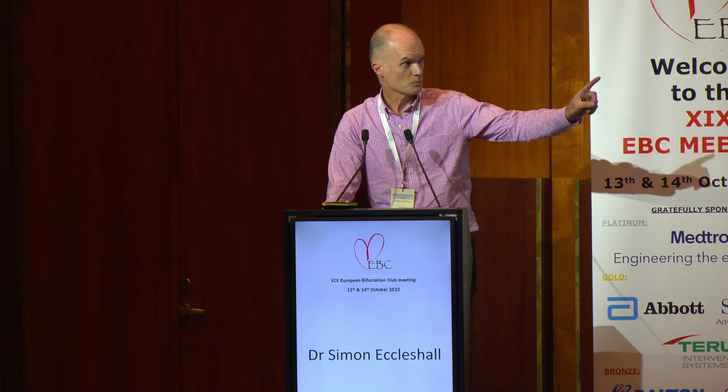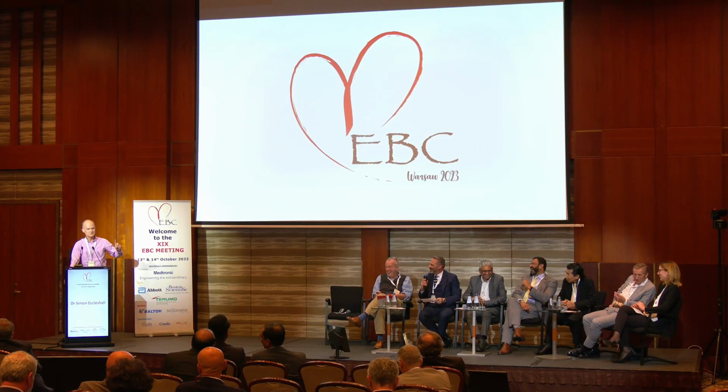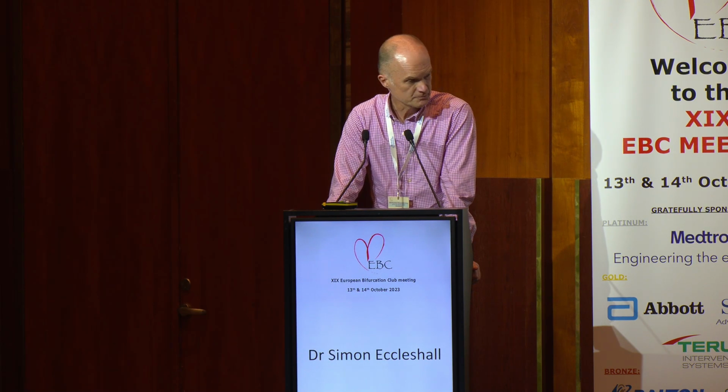Our data of left main stem work, a bit like that cohort I just showed you of bifurcations. I think we can organize a match outside. The last comment: in our left main stem cohort, between DCB only and stent only, there is no difference in outcomes, but numerically the stent arm does worse in every single outcome, though not statistically.